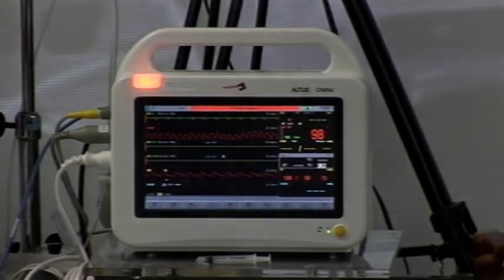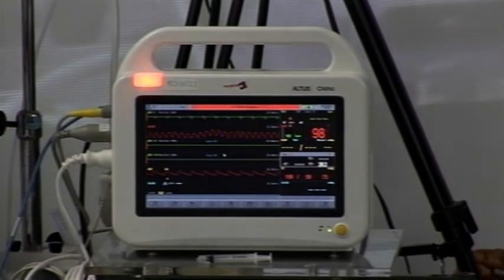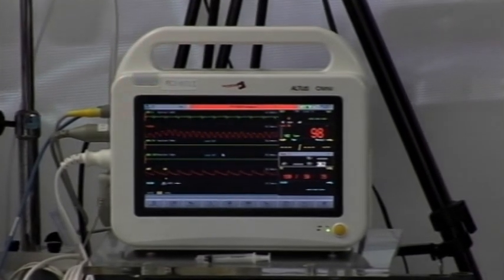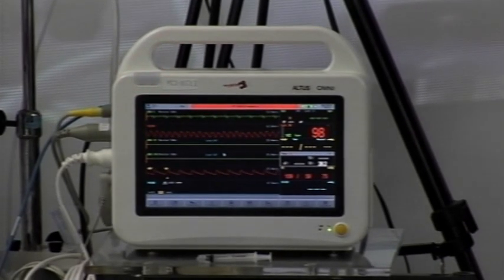And if you are not proactive, if you wait too long, or if you do like we did 15 years ago, go to sleep and come back the next morning, then you will have a pneumothorax, because you haven't weaned down fast enough. Okay?